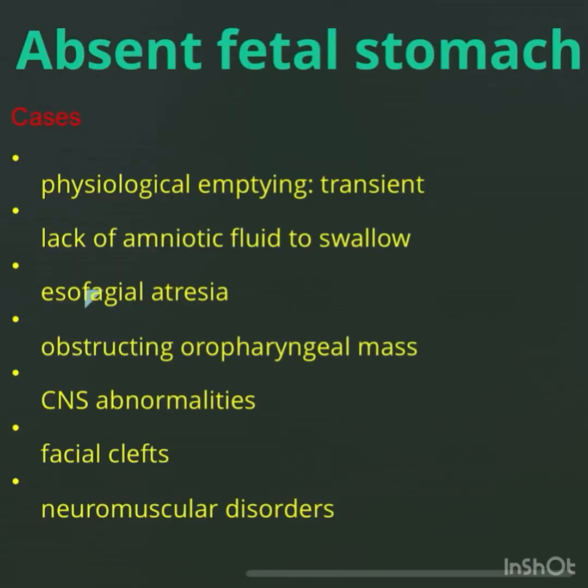Now, before reviewing our case with absent stomach, let's discuss the causes of absent fetal stomach. The causes are physiological emptying, which is the most common reason for false positive diagnosis.